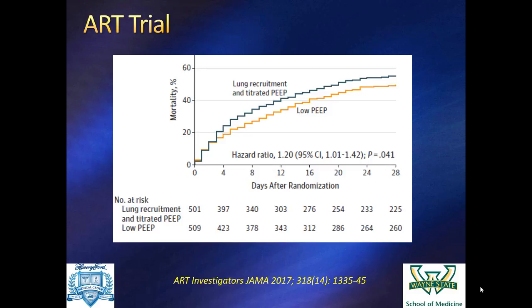In the open ventilation study, they did a recruitment maneuver for like 30 seconds and then went to whatever PEEP they were going to go to. In this study, they said, well, we want to look at compliance at every level of PEEP. So they started at a PEEP of 40, did a volume pressure curve, went down to 38, did a volume pressure curve, down to 36, did all the way down to 16 or down to 12. Then they did a whole thing while patients were intubated. They had a whole bunch of complications around just doing that recruitment maneuver. And then after they did all that, they said, yep, the best PEEP based on compliance is, on average it was 16, but it is whatever it is, and that's the PEEP they used.